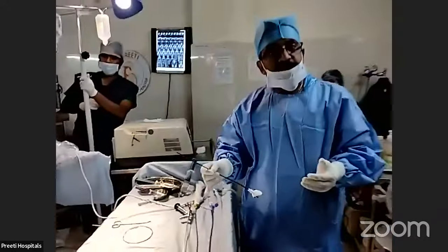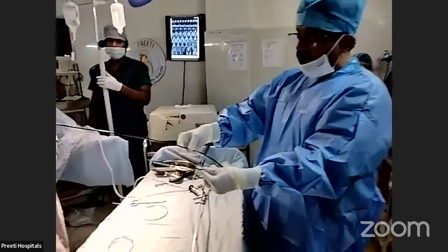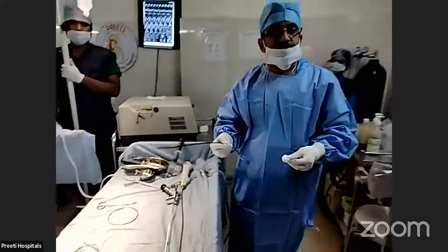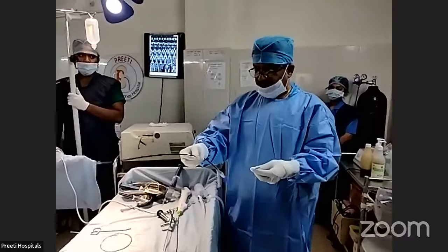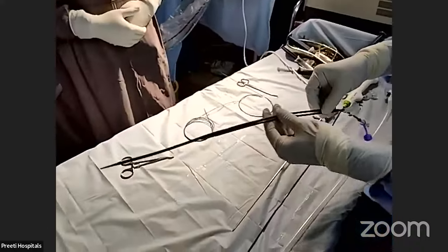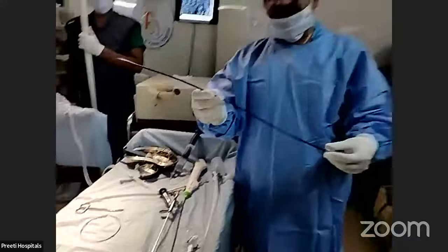I always prefer to use it in the lower end. Whereas now we are talking about, see how long the sheath is. This is almost double the size. If you see here, it's off. So is it logical? Some people have used this and said it is logical. This size is 10 French, this size is 9.5 French. Unless you keep it by the side, you will not be able to feel the difference. The tip is same for both. The material is same, but this company is different.